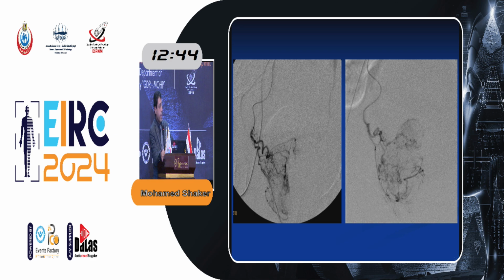It ends by 2 branches, usually a central branch for the adenoma and a peripheral capsular branch, as you see here. The central branch supplies the adenoma, and the peripheral capsular branch, as well as here, central and peripheral capsular branch.